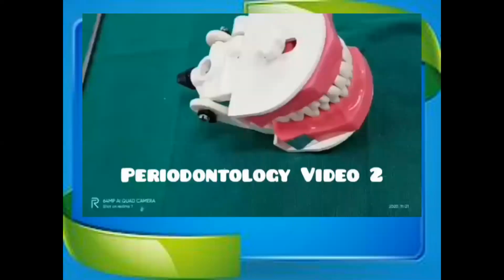So this is a video demonstration for finger rest.